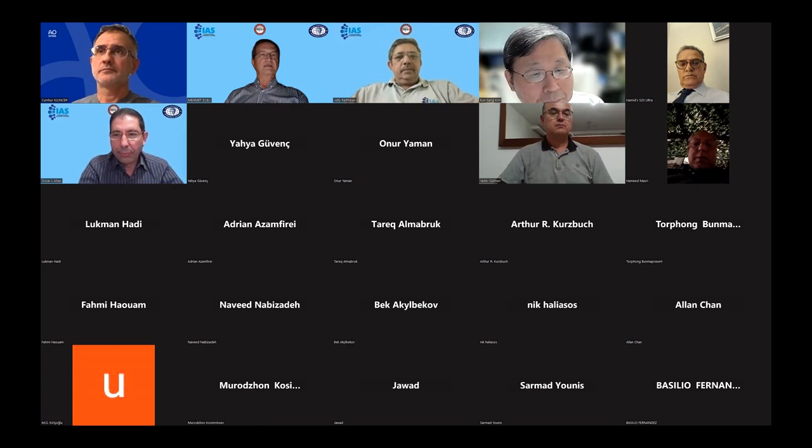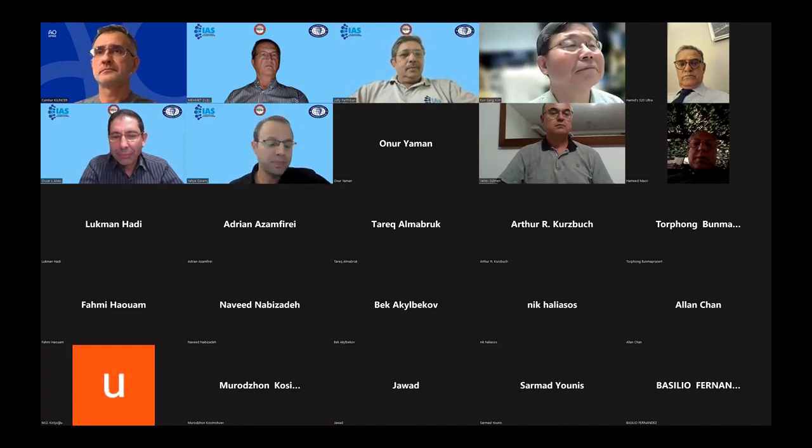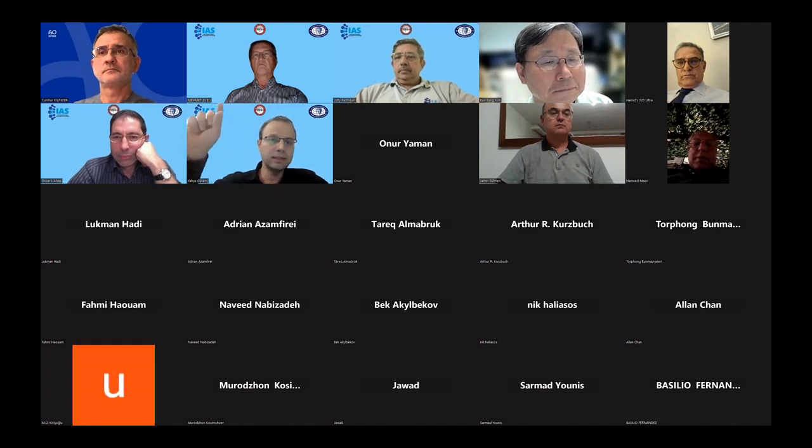Yahya, do you want to say something? Yes, I wrote a question on the board for Oscar about multi-level arthroplasty, because sometimes we see subsidence, and biomechanics is different in upper and lower cervical levels. In the upper level, flexion is more than in the lower level, and sometimes we see subsidence between C4 and C5 arthroplasty. What do you think we should choose, a hybrid system or something different?